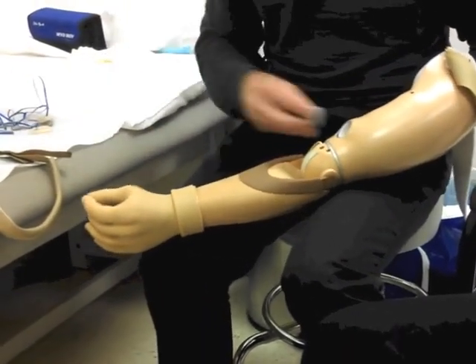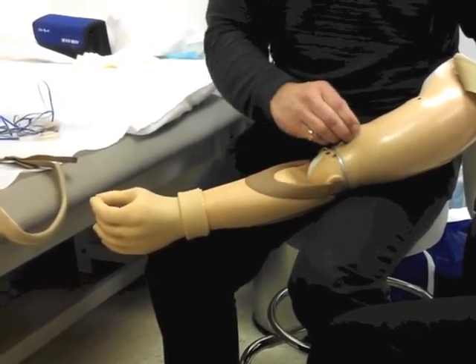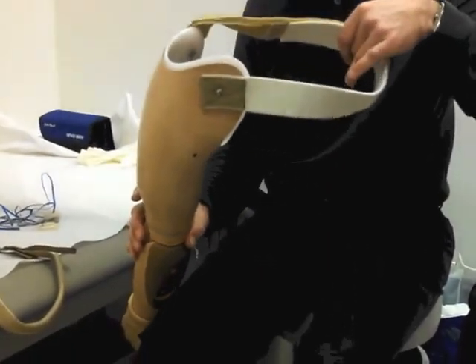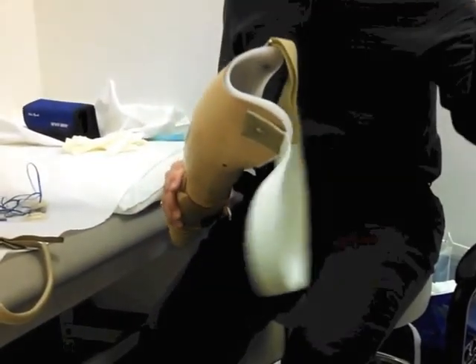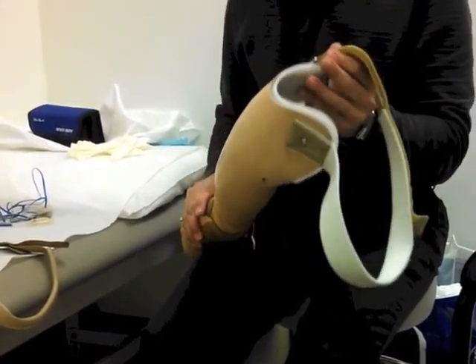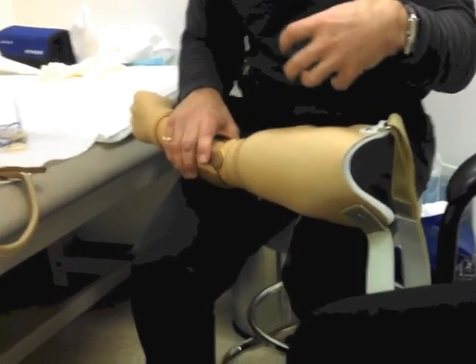Once you put the valve on, it creates a negative pressure. When that negative pressure is created, the harness is a secondary suspension. You're technically holding the prosthesis up with your arm, but the harness keeps it close to you and also provides suspension — it does both. But the main suspension is your arm being inside, held by the valve.